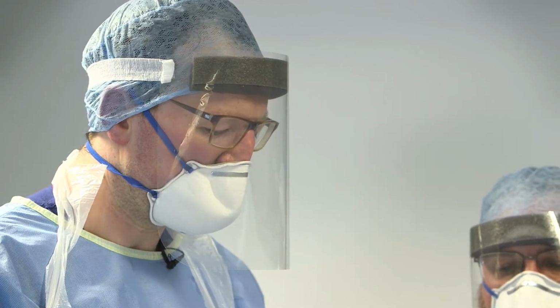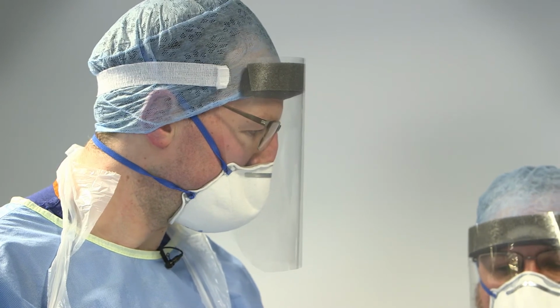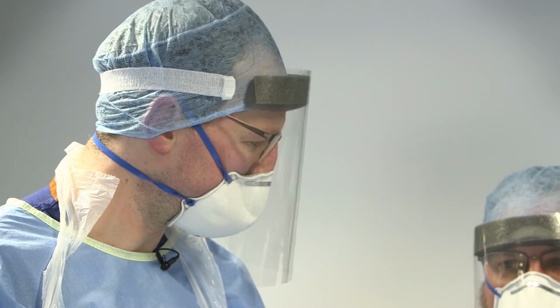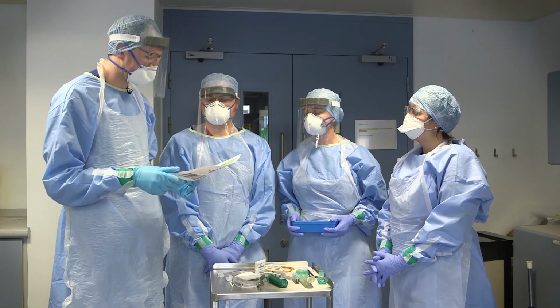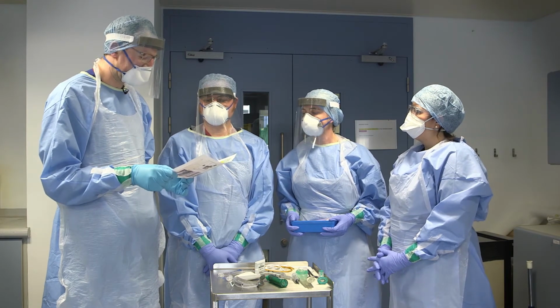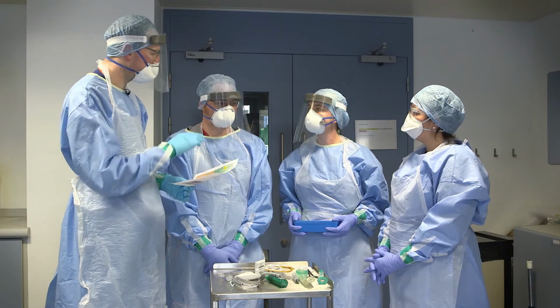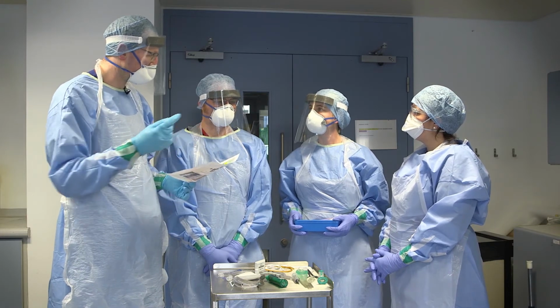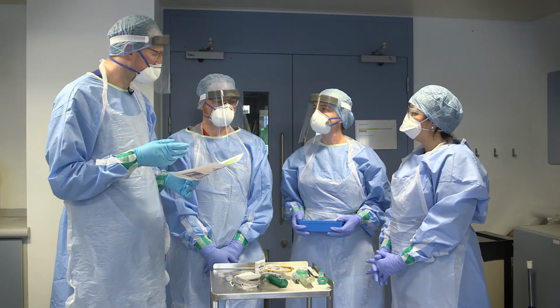So plan B, to maintain oxygenation, will be an i-gel, and failing that, we'll move on to bag mask ventilation, which will be a two-handed, two-person technique. So I will maintain the airway, and if you're happy to ventilate. Yep. If we fail at that, I'll declare a can't intubate, can't oxygenate situation, and we'll move on to plan D, which is front of neck access. At that time, if you're happy, we can swap roles. So you will come around and hold the airway, and I will be performing the front of neck access.